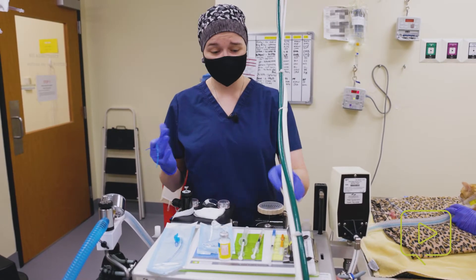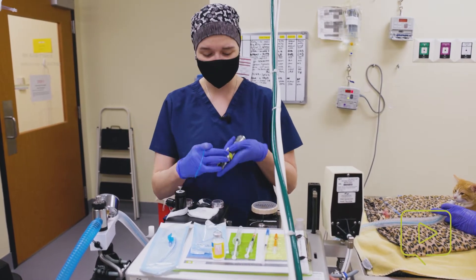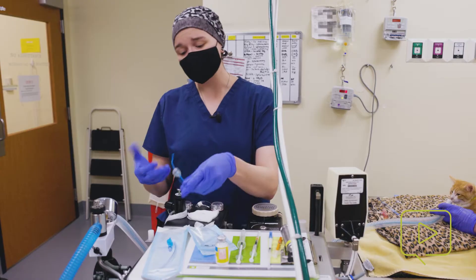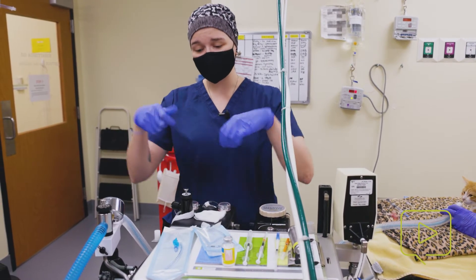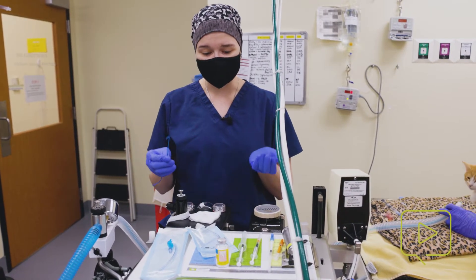The placement tools that are still very helpful for cats — we can continue to use a laryngoscope. The blades are just going to be a lot smaller than for dogs and a little narrower. We can use a stylet; the goal of this is to stiffen the tube. The smaller the tube, the more flexible it becomes and it can be difficult to pass down the mouth and into the trachea. The stylet just adds a little bit of stiffness.